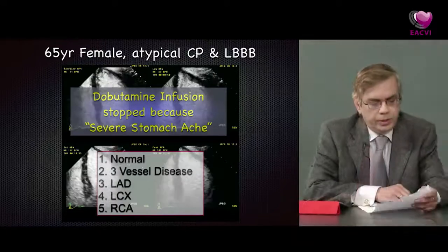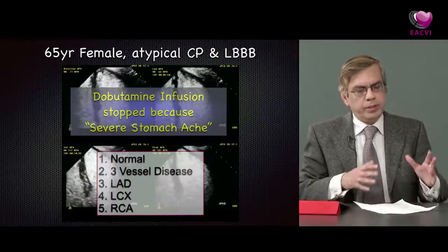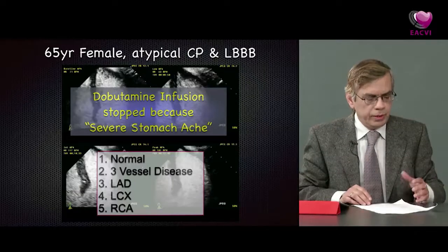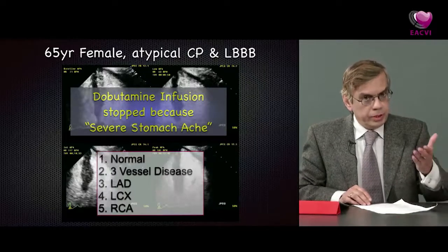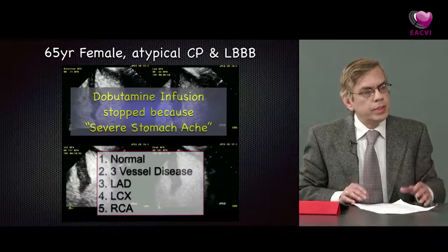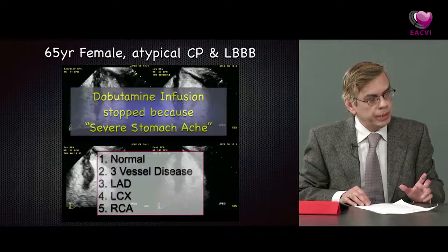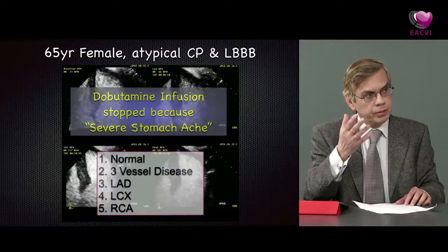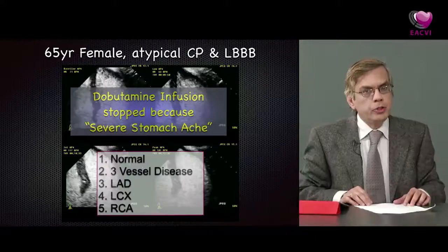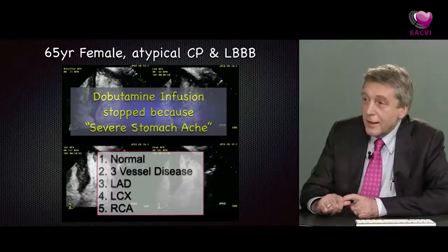So while the voting continues, another question for you, Mark. Again, it's because it's a session on how one does contrast stress echocardiography, especially now that you're talking about myocardial perfusion. We are all aware that we do see some basal perfusion defects, which may not be truly defects, or even apical defects, which may be pseudo defects. This is not uncommon. So how do you decide whether it is an artifact or a true defect? In your practice, how do you do that?